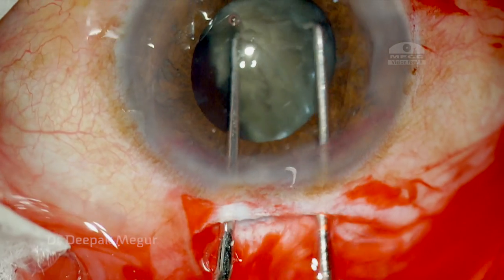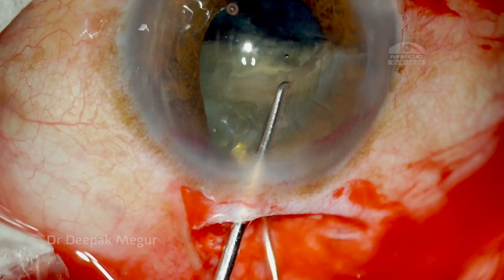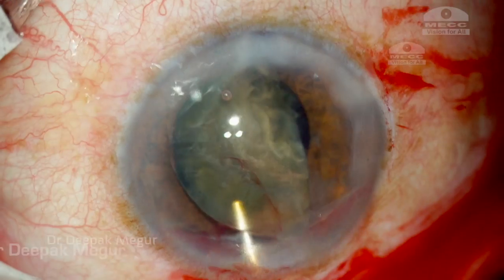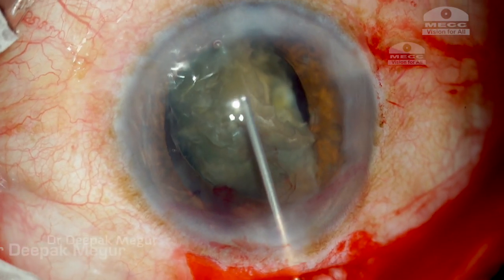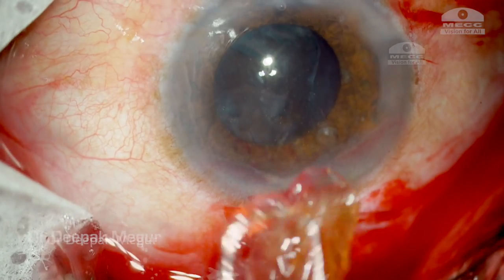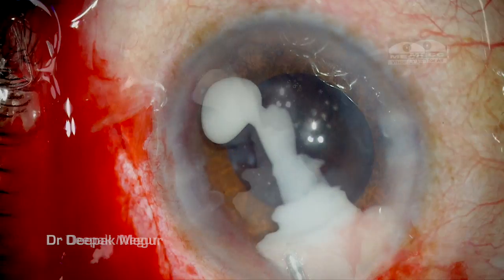Then the large, heavy nucleus is gently maneuvered out of the bag using two Sinsky hooks. Adequate OVD is constantly being used to protect the corneal endothelium. It is then extracted out using a vectus and a dialer.